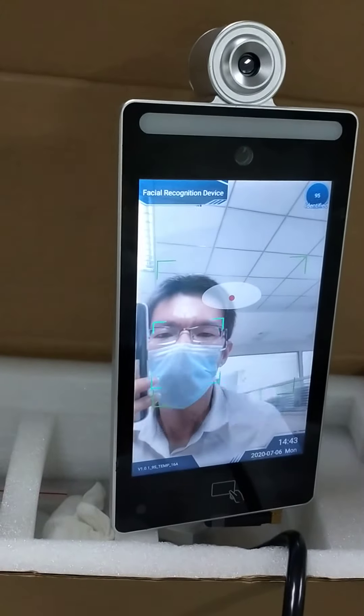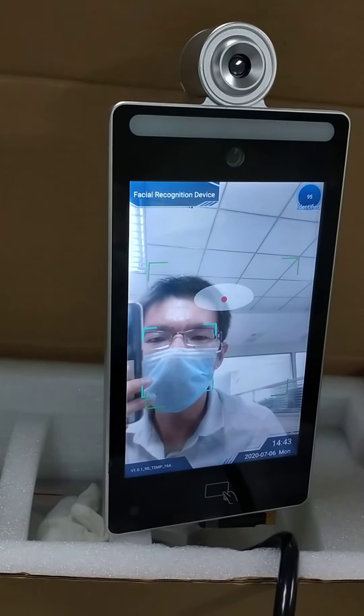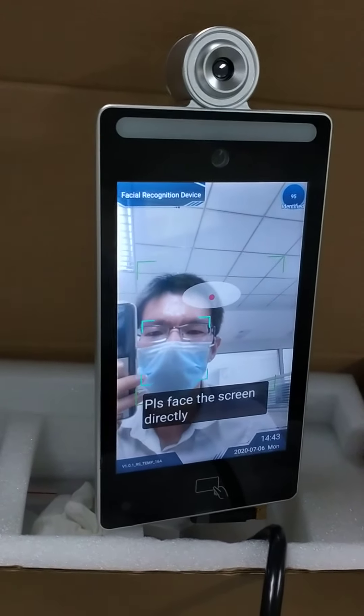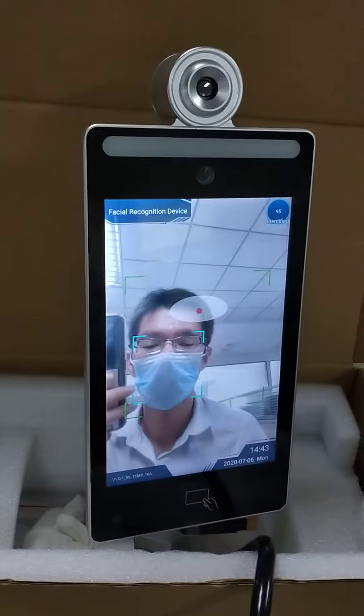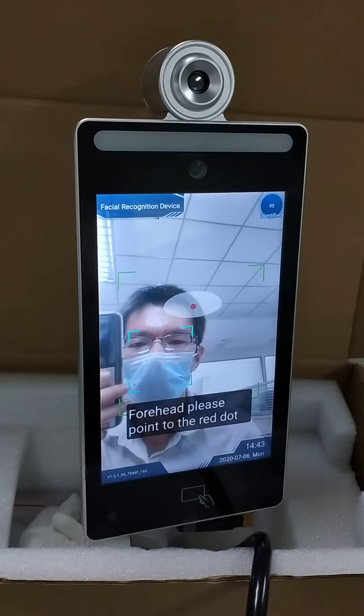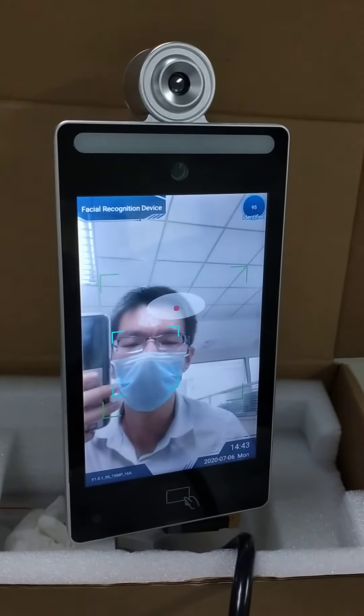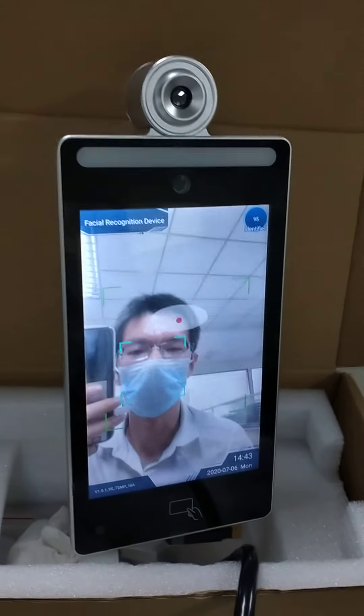Hello everyone. When you're using the facial recognition and temperature detector, how can the administrator know when there comes a fever?